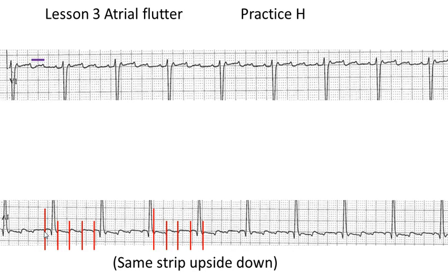In this case, I started measuring with the flutter wave that began before the QRS — starting here. From here to here is one flutter wave, second flutter wave, third flutter wave, fourth flutter wave, and now I'm back at the beginning of the QRS. Over here, I started behind the QRS at a nice little dip: one flutter, two, three, four.